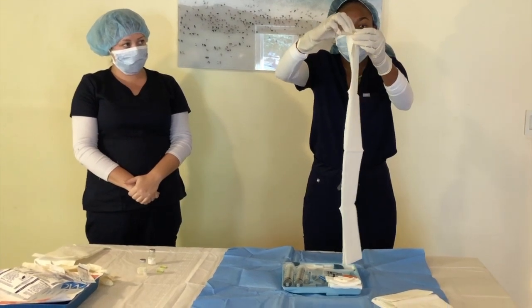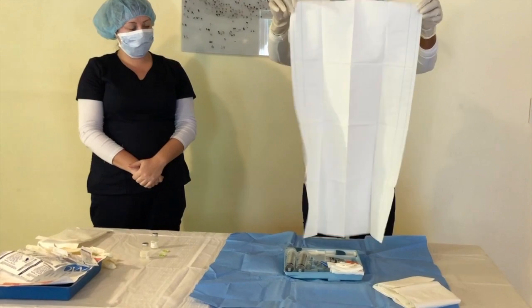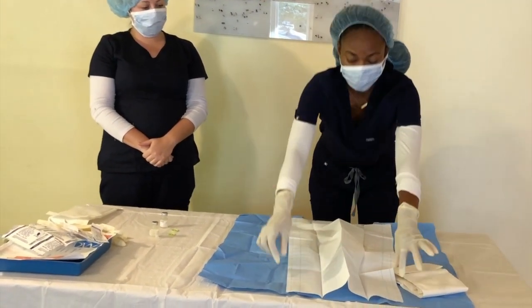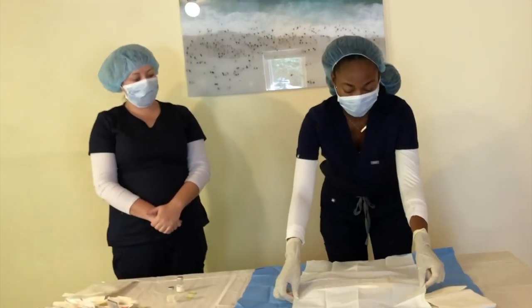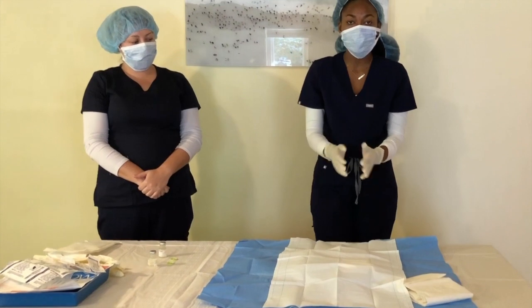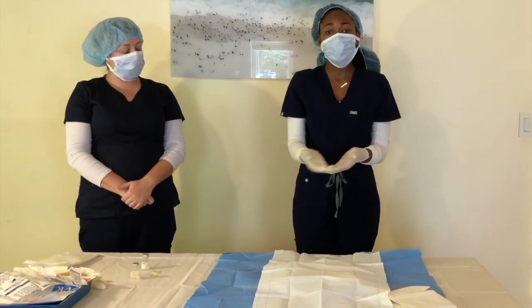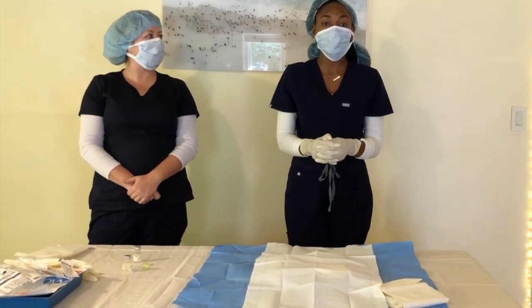I'm going to touch the edges. But even though I'm sterile, it's okay if I touch more of the edges. I'm gonna make sure it's nice and open. And then I'm gonna cover everything with it. And we can get it to look nice. And this is also nice too, because no debris or anything is falling on this. And also it's less intimidating when the patient comes in the room and can't see everything that's about to be stuck inside their body. It's kind of also a nice, respectful thing to do for a patient.